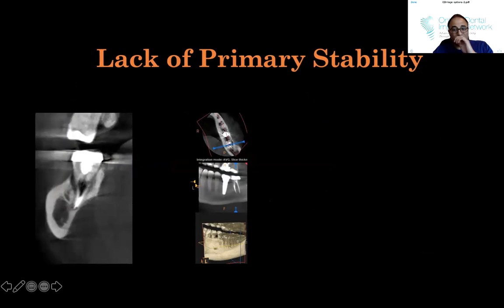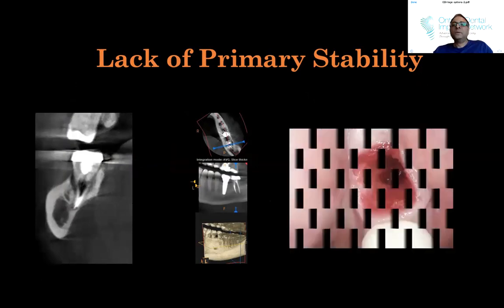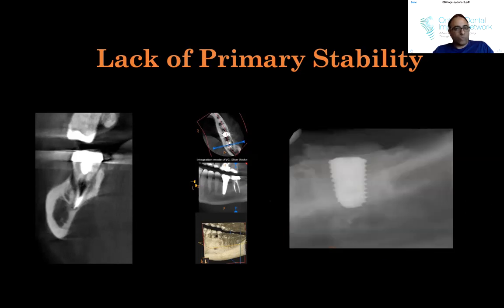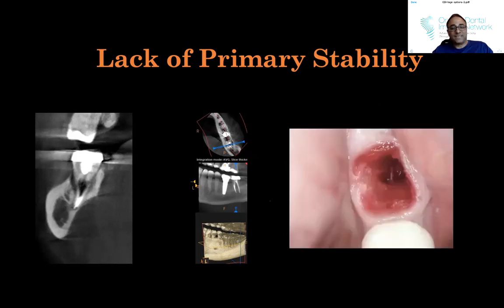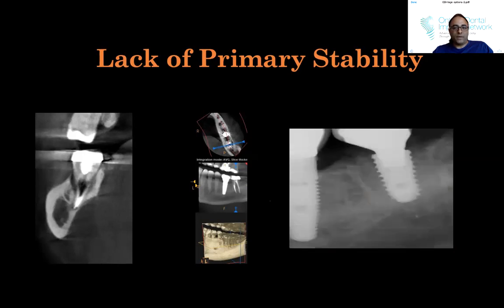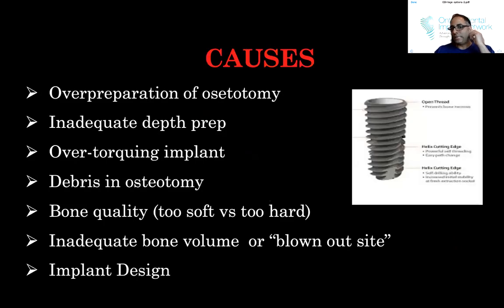And the patient actually was on a timeline, of course, as all patients are, right? So by the time you remove a tooth like that, the site is conical, it's blown out. I mean, there's nowhere to place an implant, right? Right? Wrong. Okay. This is the case on the right side where the site was completely blown out. And I did place an implant with bone. And I'll talk a little bit about that. And there's the final restored case. A little bit about how crazy you can really get depending on how big you are.